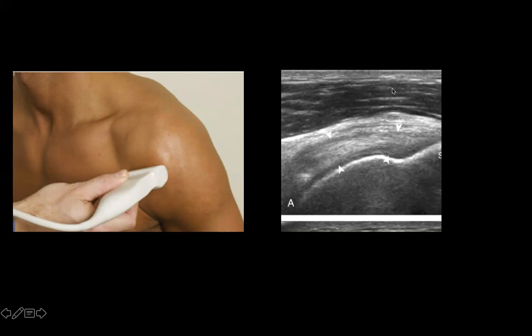In the normal image, we have the subcutaneous fat, then the deltoid muscle as the second layer, then the peribursal fat with no fluid in the subacromial-subdeltoid bursa. All these hyperechoic fibrillar structures are the supraspinatus tendon, and here is the greater tuberosity where the tendon fibers are inserting. Notice there's no anechoic or dark defect in the tendon to suggest a partial or full thickness tear — that's the normal structure.